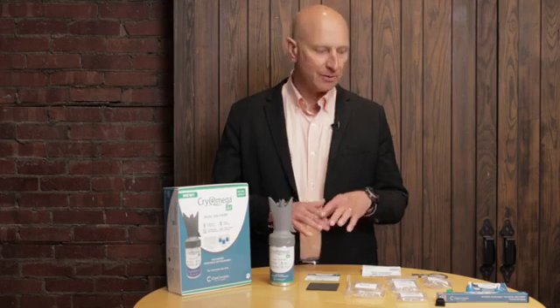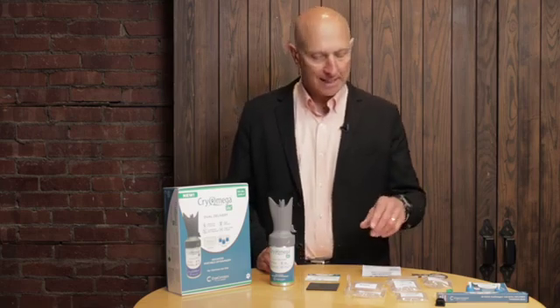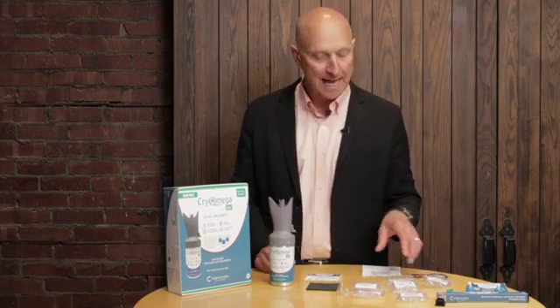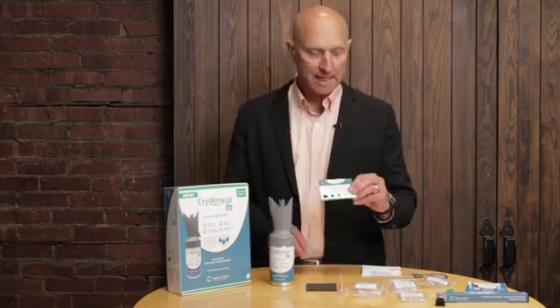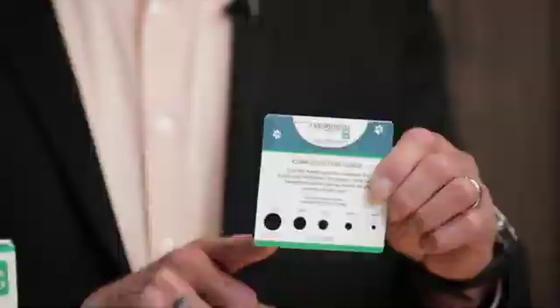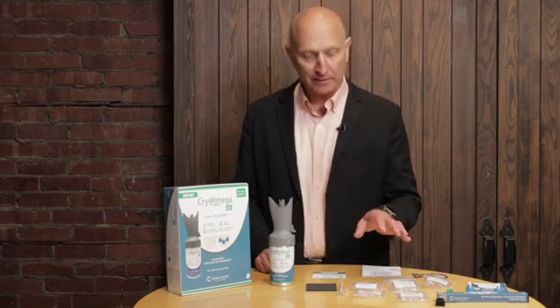So let me first go over a quick review of what's contained in the kit. You'll notice as you take the components out that there are both cones and buds that may be used with the unit itself containing the gas. Now there are cone tips, and the way this all connects is that there's a treatment guide for the veterinarian in which they can match up the lesion that they want to treat and the size tip to use. So in this case, let's talk about a cone tip treatment that's going to be 5 millimeters.